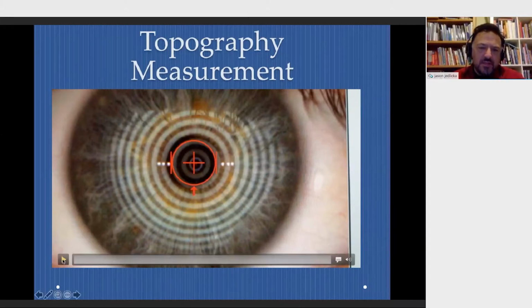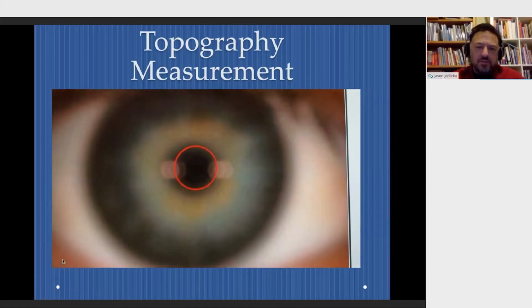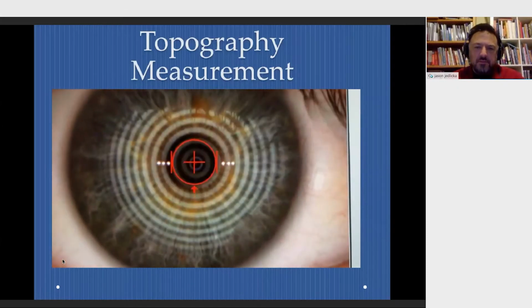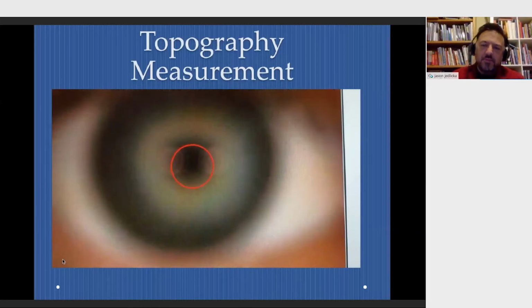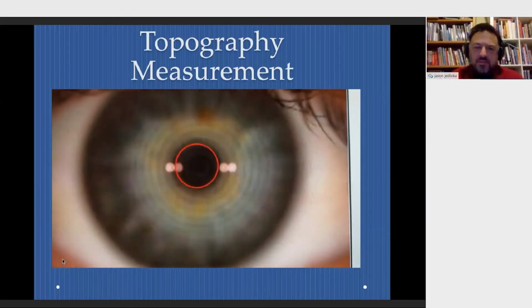But this is just capturing a Keratograph. You just push in until you come into focus. You'll start to see the arrows appear, and the arrows just help you to align, and once everything is lined up, it just automatically captures. So again, it's quite an easy process.